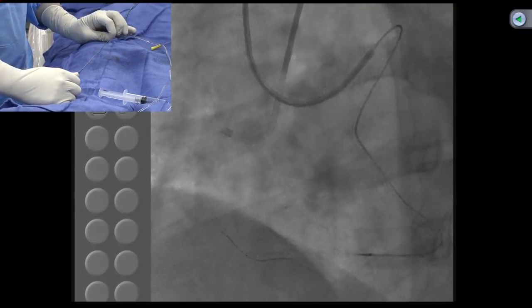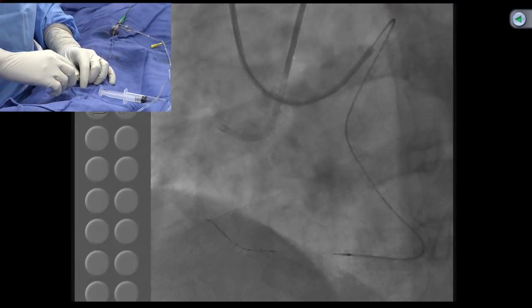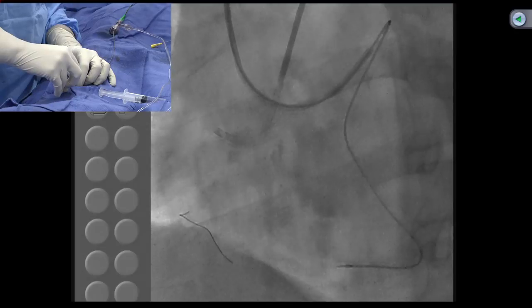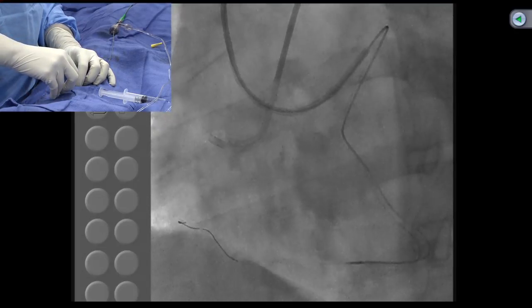Particularly with the corkscrew, you can turn the Corsair up to 15, 16 times in each direction. And then, of course, when it gets too much turn, you do counterclockwise. Now, once you do a counter turn, that guide will suck in. So make sure the guide is out in that situation.